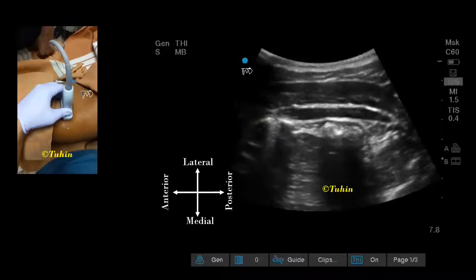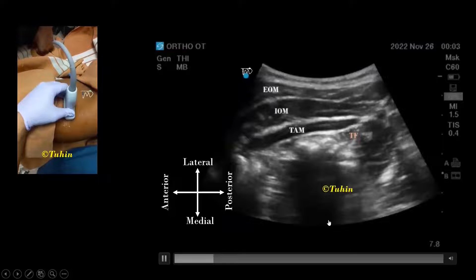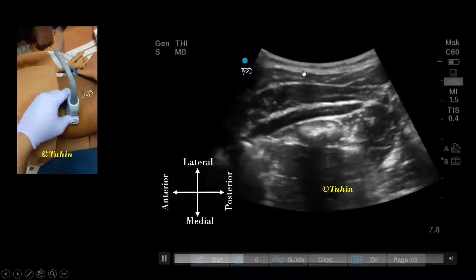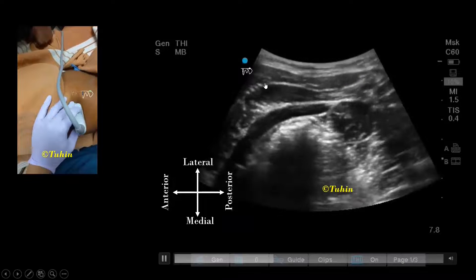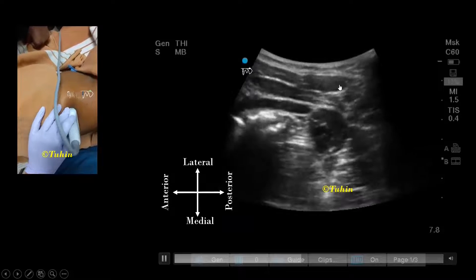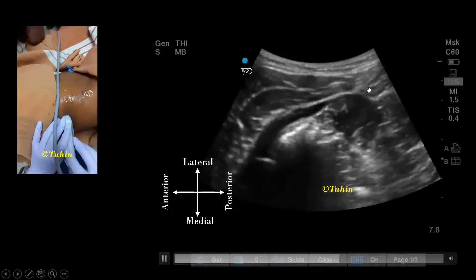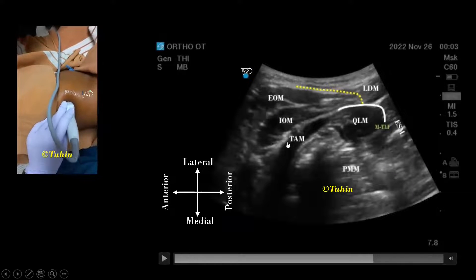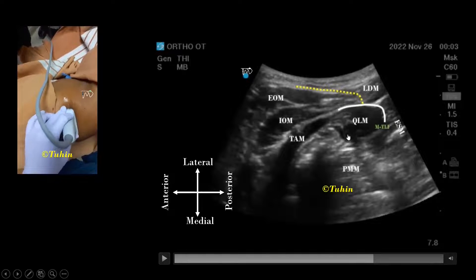Scanning starts from the anterior abdominal wall, just as in the transmuscular quadratus lumborum block. Gradually slide the transducer posteriorly and cranially until the three layers of the abdominal muscles are identified. The external oblique muscle is then followed posterolaterally until its posterior border is visualized, which forms the hook sign. The internal oblique muscle below it forms a roof over the quadratus lumborum muscle.